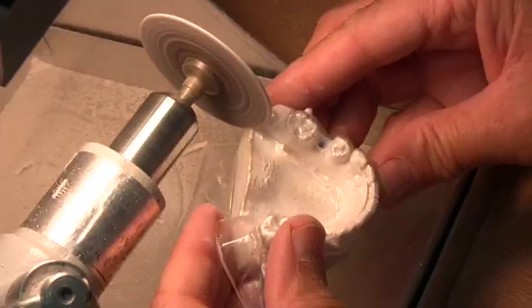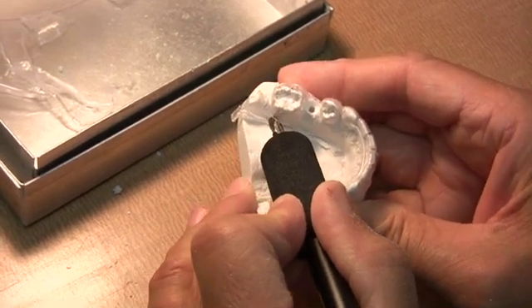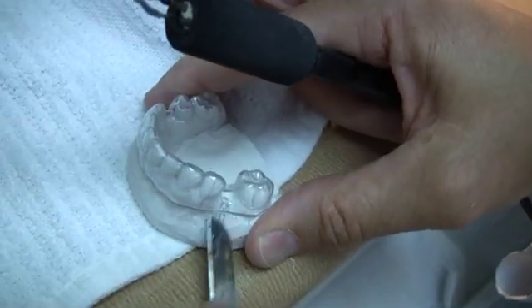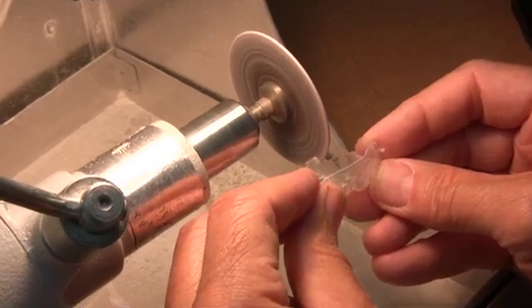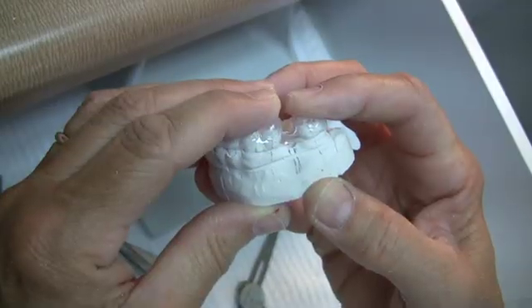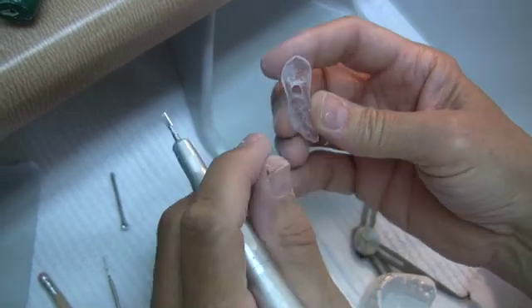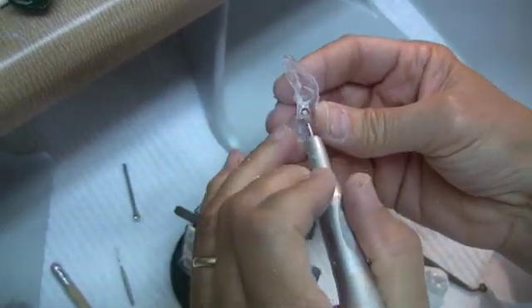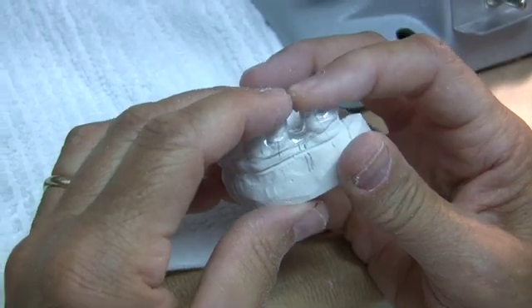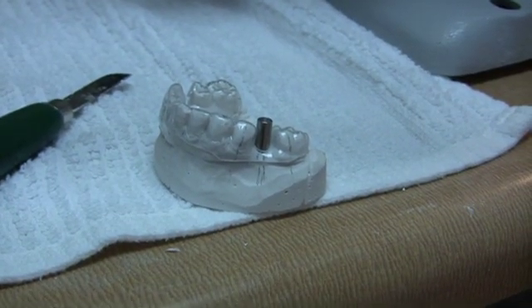The guide is carefully trimmed for removal. A pro-electric knife is helpful in sectioning the guide for removal. After removal, the guide is trimmed and smoothed with a felt wheel. The guide can then be checked for undercuts which will make it difficult to seat — they should be trimmed. Not shown in the video but helpful at this stage would be to coat the model with separator. The guide is now ready to be seated on the model and the pin placed for creating the channel.